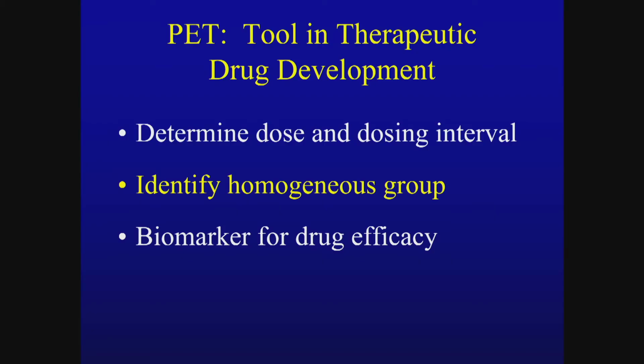Okay, so that is commonly done in most pharma companies that I'm aware of now, at least for CNS drugs, central nervous system drugs. If they begin to look at a new target, right at the time that they identify some new target that they want a therapeutic compound for, they allocate resources, money, people, supplies, to also make a PET radioligand for that target so that it is ready in the initial human studies to determine, did the drug actually get to the brain?